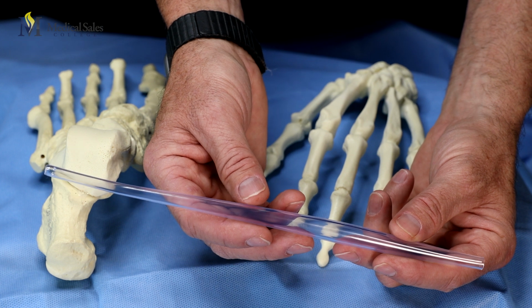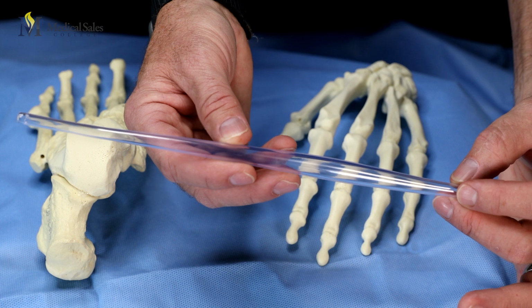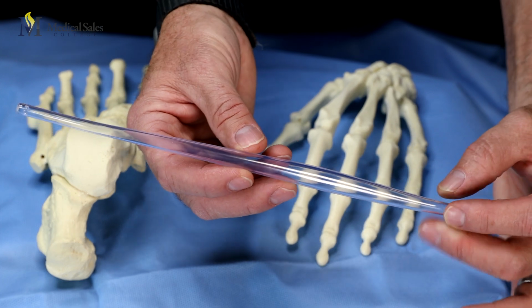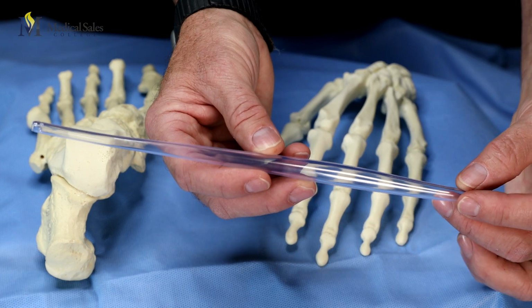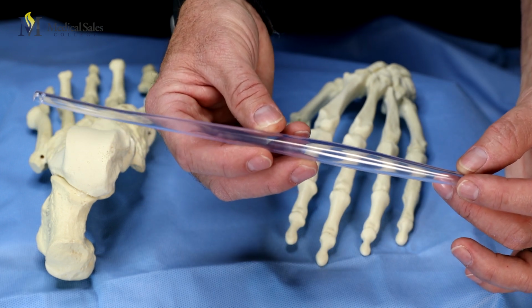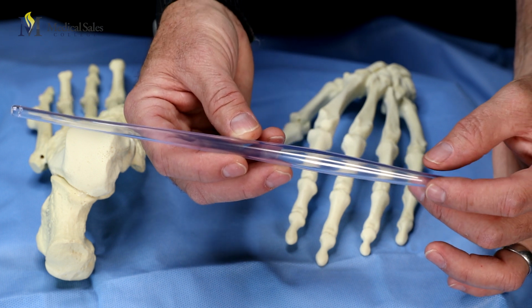Suction tips are used to efficiently remove blood and other types of fluid from the surgical site for improved visualization. These suction tips are very smooth as to not damage the soft tissue structures around the area that we're working in as surgeons. And finally, we talk about miscellaneous instrumentation.